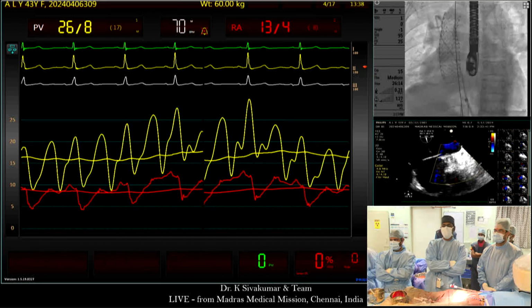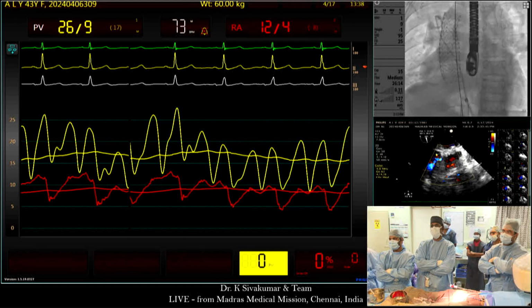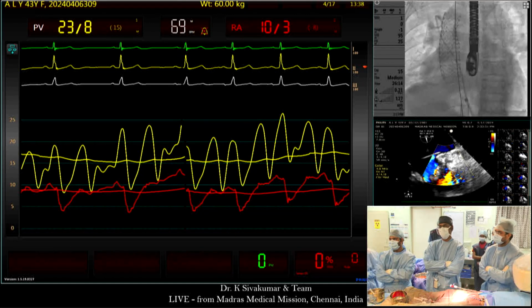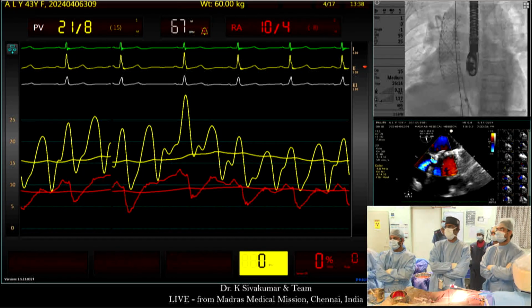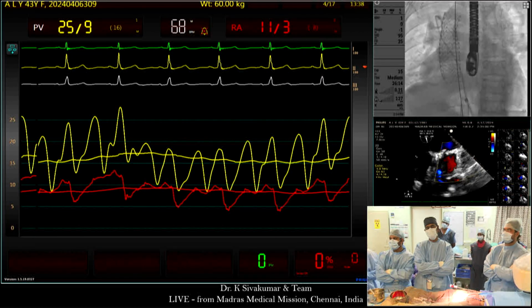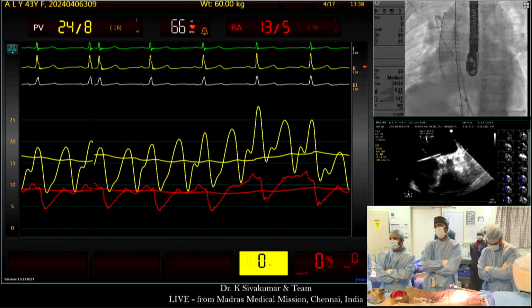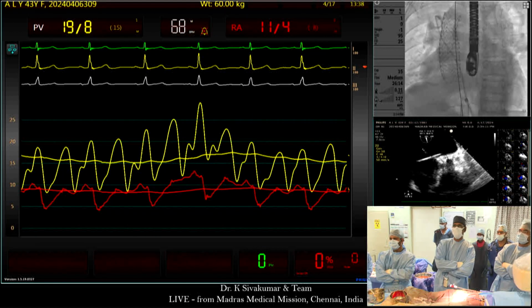On the contrary, when the surgeons do the dissections, the epicardial artery is more likely to be traumatized, not necessarily directly, but even by the incisions in and around it, which will produce fibrosis and will lead to sinus nodal arterial strictures over a period of time. So the chances of sinus nodal injury with either a balloon expandable or a covered stent are by and large very uncommon, the reason being the artery is epicardial.